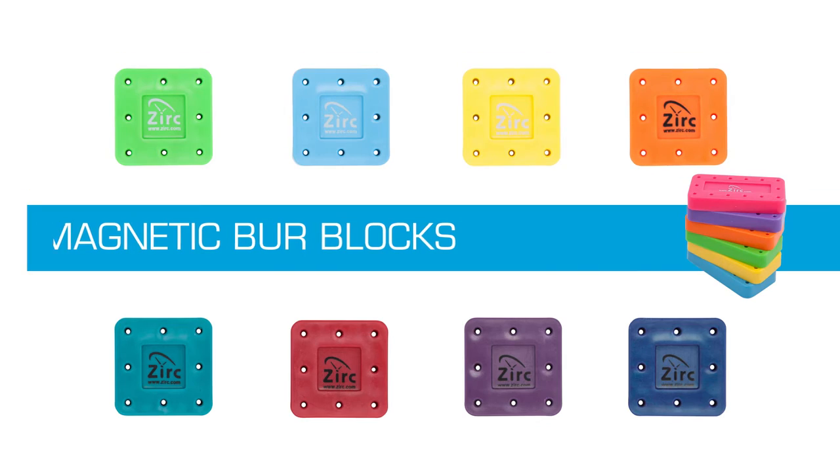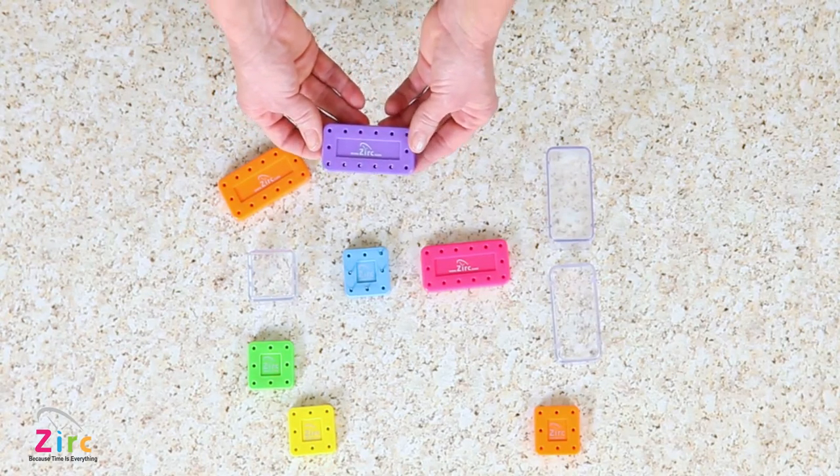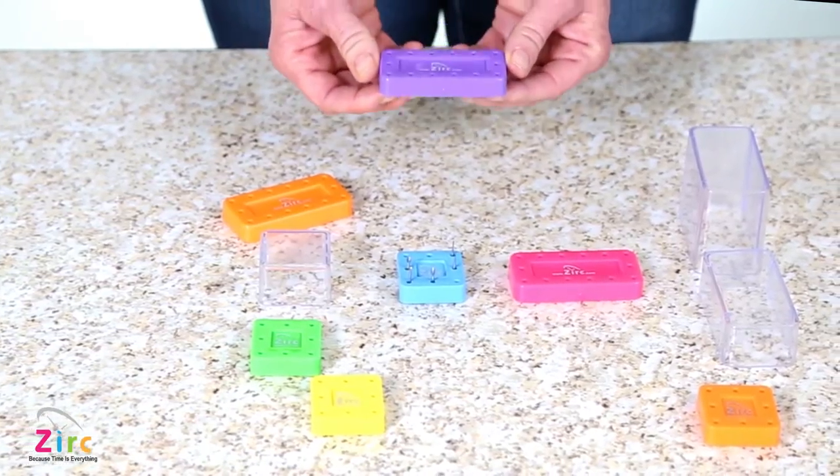Hello, today I'd like to introduce you to Zerk's magnetic burr blocks. The magnetic burr blocks conveniently come in two sizes: a 14-hole and 8-hole burr block.